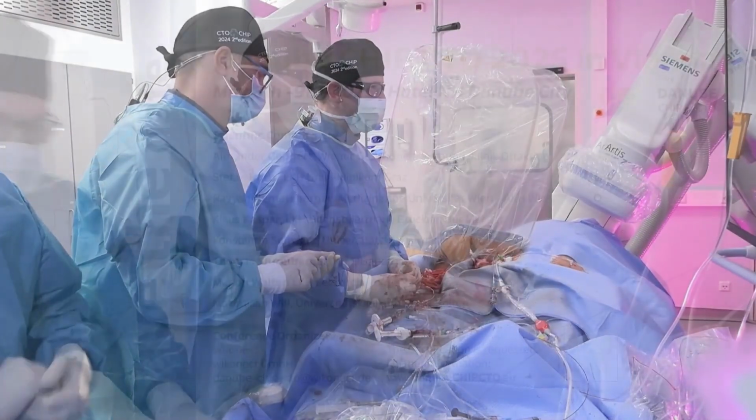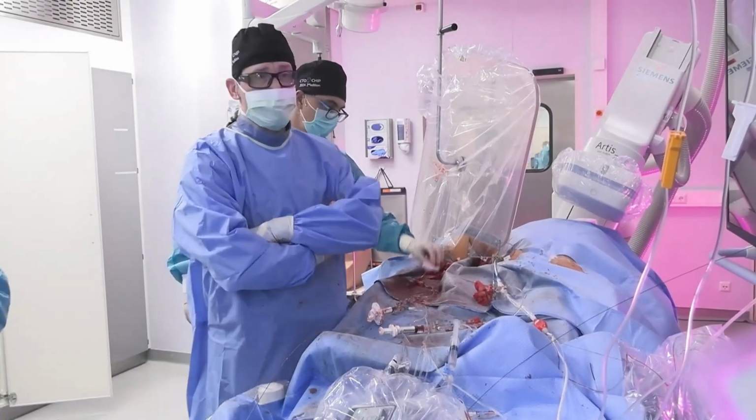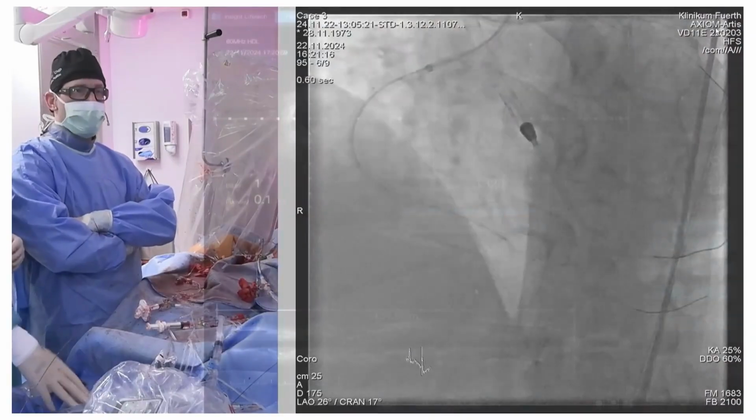Yeah? Felix? Hello, Felix. Hello. Sorry for being rude. So we just want to show you the IVUS. Welcome back. I hope you had a good coffee.